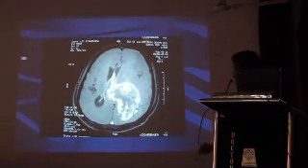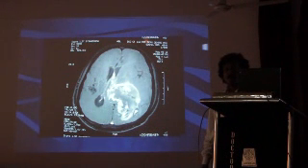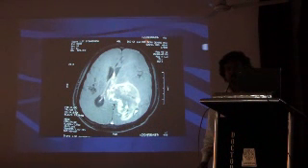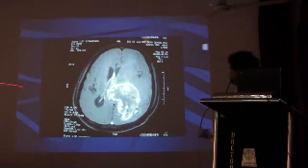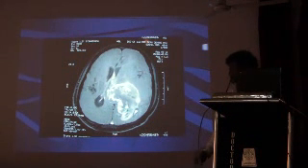Now, if you look at this one, what image is it? T1, yes, T1, right. Because look at the TR and the echo time, short TE and short TR. Sorry, here the TR is slightly increased, I'll tell you why. And how we look at what to see in the film, I'll show you in the next few pictures.